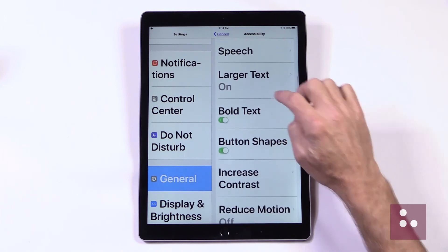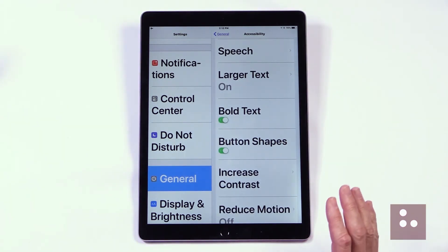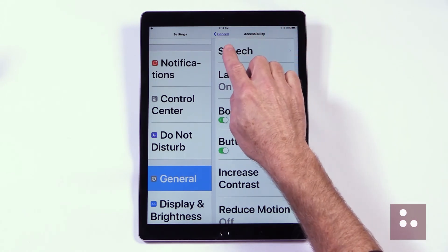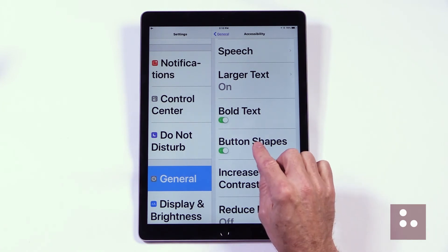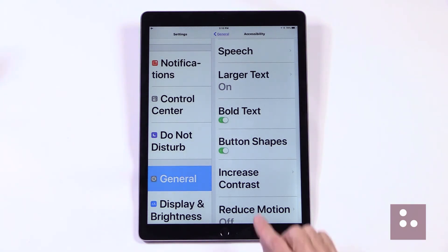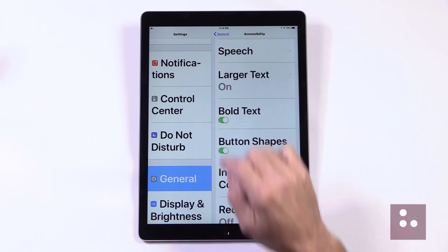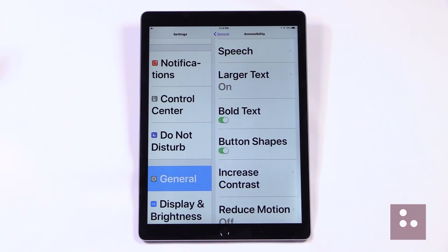Our next feature is Button Shapes. Our Button Shapes feature makes identifying the buttons on our page so much easier. This is an easy feature to turn on because there's simply an on-off toggle switch right here in our list. We can see how it really can help by enlarging our Back button or giving us an outline around our Back button.